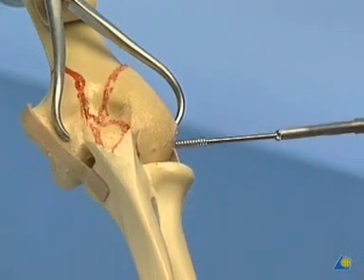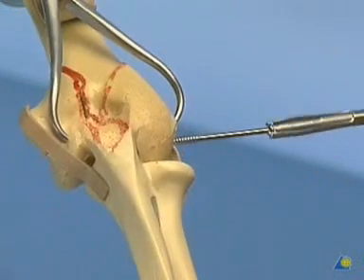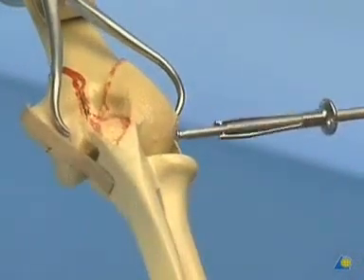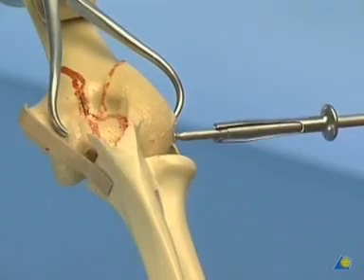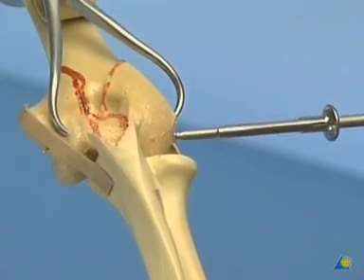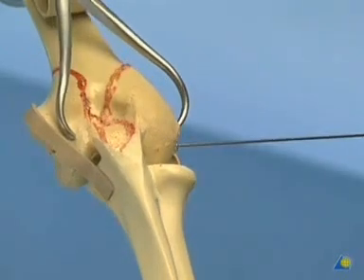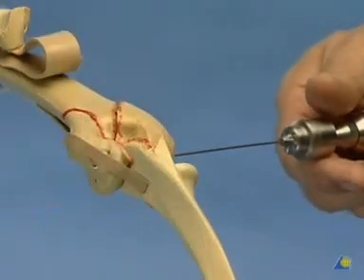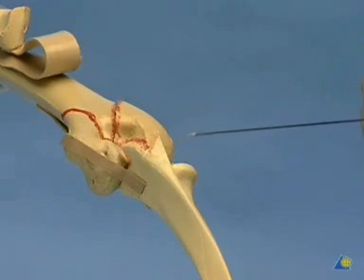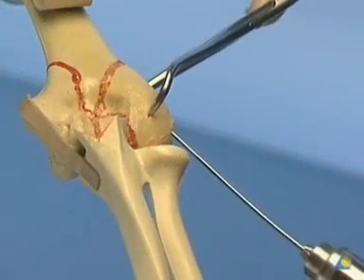Insertion of the 3.5 mm cancellous screw. Tightening the screw induces interfragmentary compression, securing the articular fragments to make them one block. Clamps and K-wire are removed. This block is now reduced to the shaft of the humerus. K-wires and/or pointed reduction clamps may be used to hold this second step.